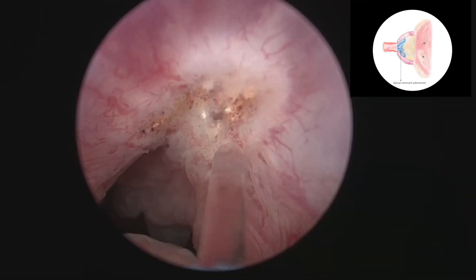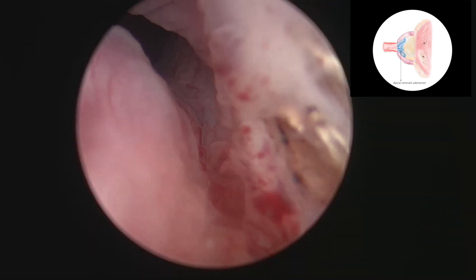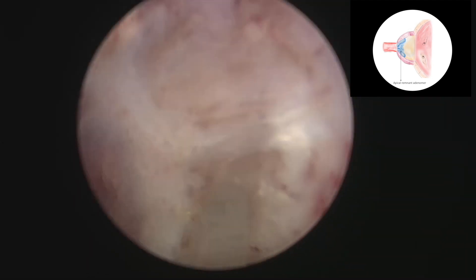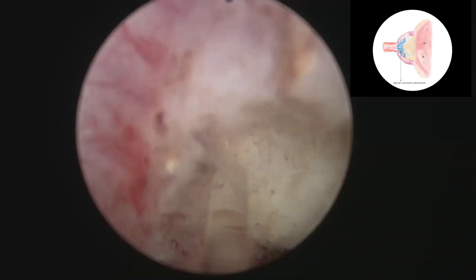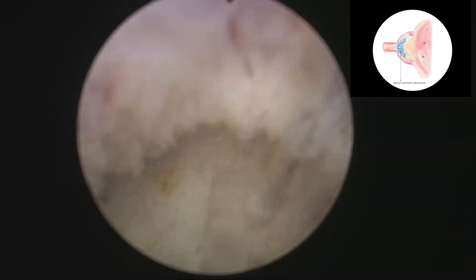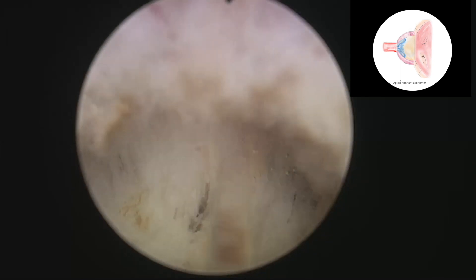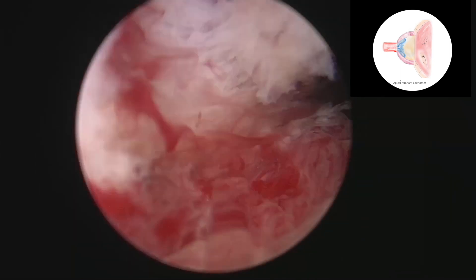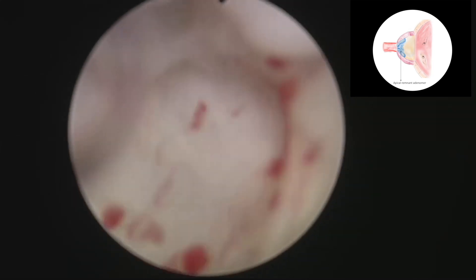Again, right at the interface between sphincter and adenomatous remnant, we performed a circumferential incision. This incision allows us to separate the sphincter from the apex right at the edge, allowing for a total deobstruction of the bladder outlet.